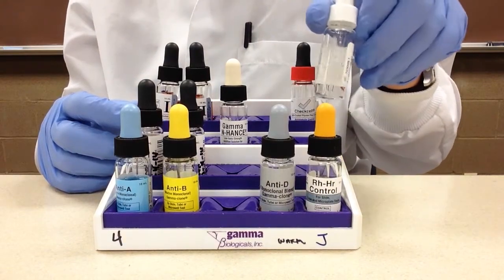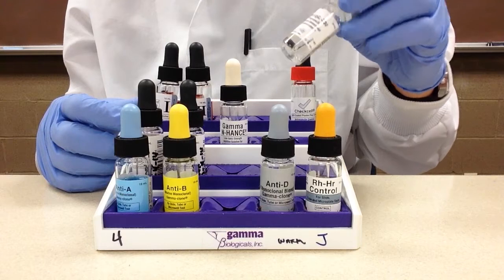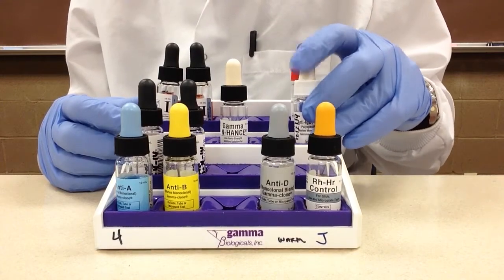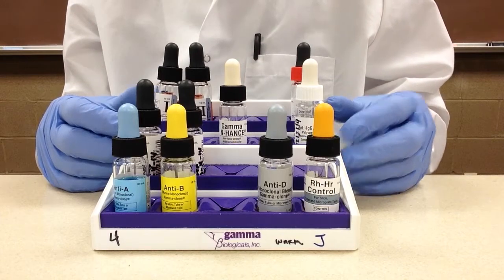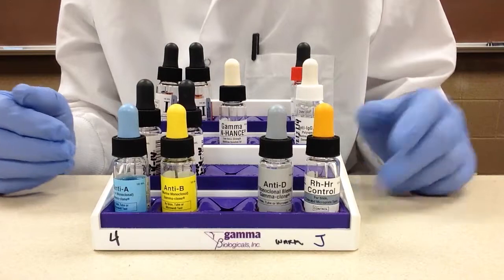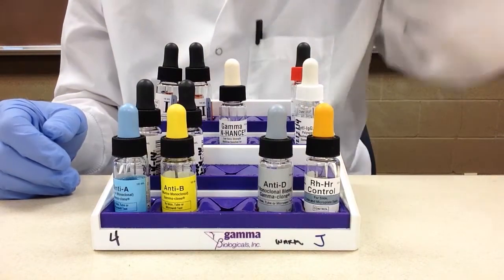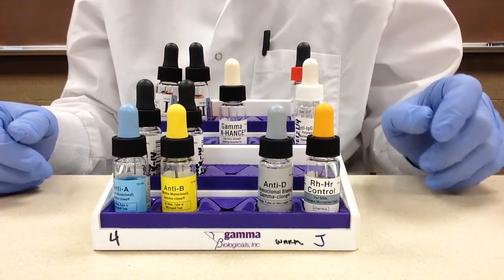One thing about this reagent — we are using a clear reagent, but most facilities are going to be using a colored reagent, and that color is oftentimes green. This is because it's very important to be able to tell when you have added reagents to your tubes, since things can get confusing in the blood bank lab and different measures are taken to ensure that testing is performed correctly.